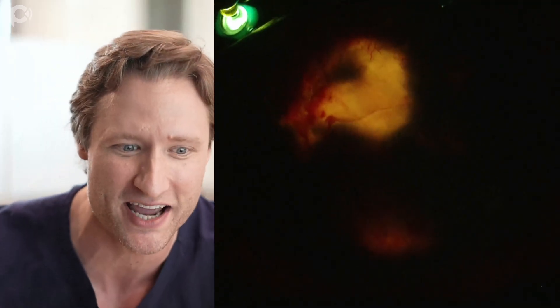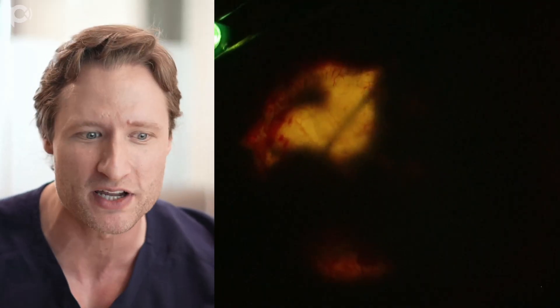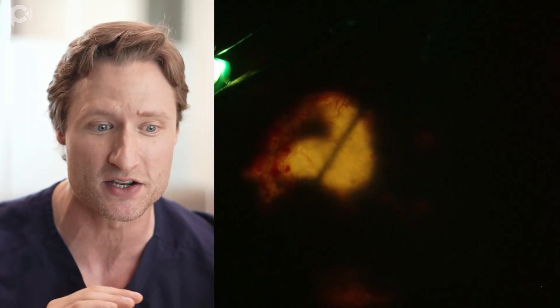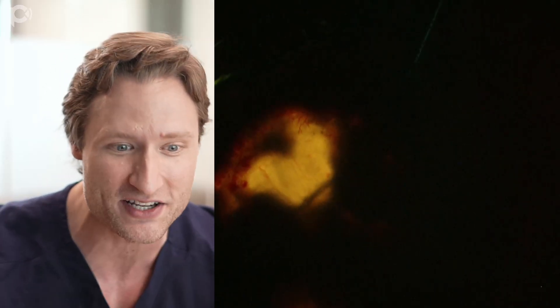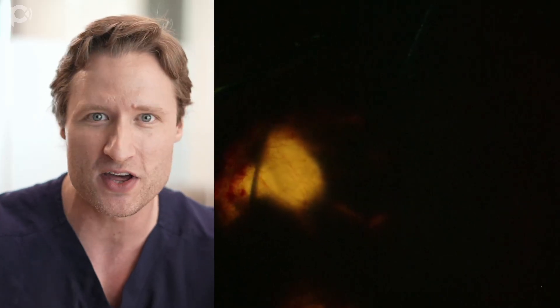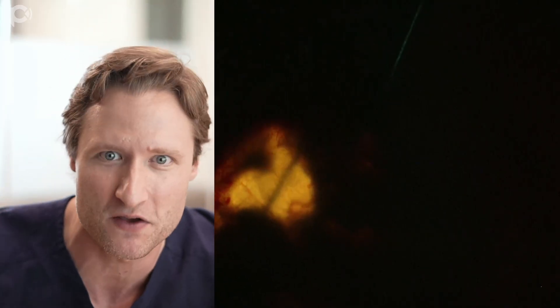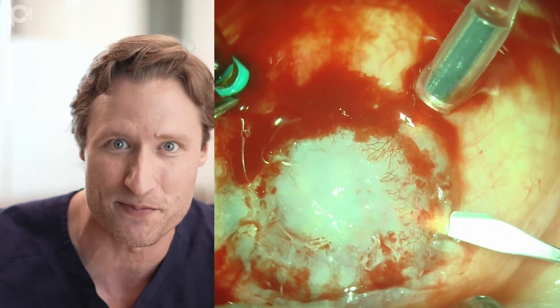I put an anterior chamber maintainer in, and this is a cyclodialysis spatula - I'm just interrogating what's going on inside the eye. I'm noticing two things: number one, the chamber is deep. That's great. I was afraid that everything - the lens, the iris - was all smashed up against the back of the cornea, but the fact that I have room to maneuver this cyclodialysis spatula is incredible.